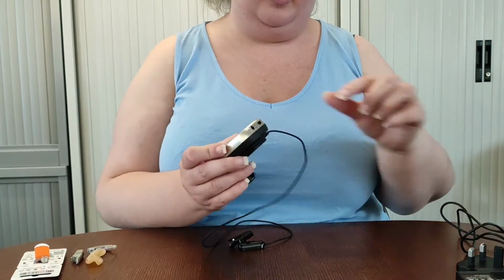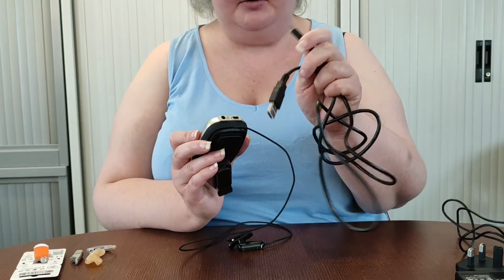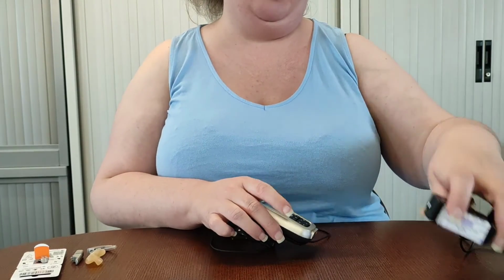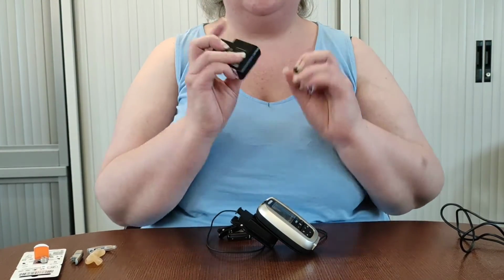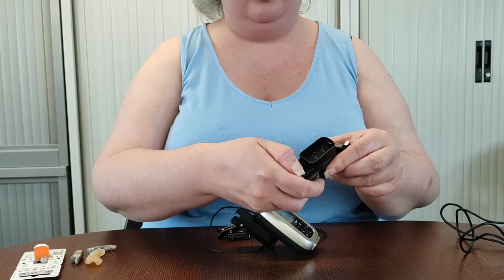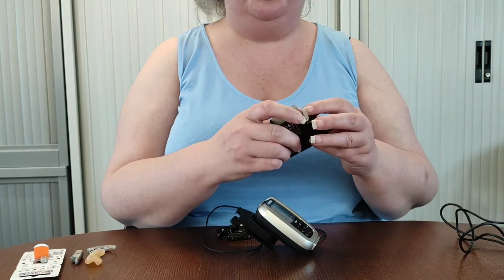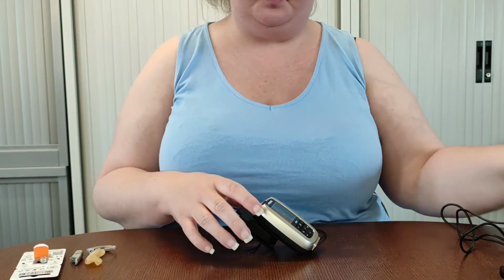And then also we have another charge port. So we have our charge cable. So we need to make sure that this device is charged daily at the end of each day. We also have a plug, so you can attach that with the USB to a computer, but I would suggest using the plug because it's a bit more efficient. So we need to pull back and then slide the front and the back and then release, and then we have our plug. Okay, and we have the USB end on that plug.